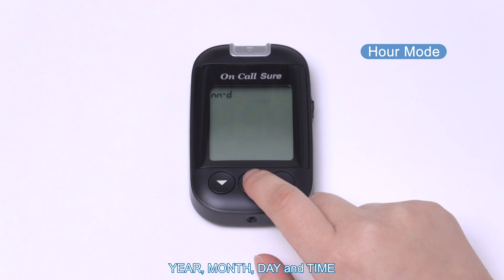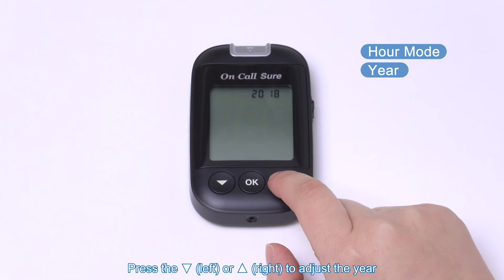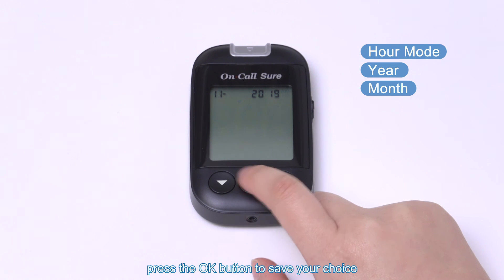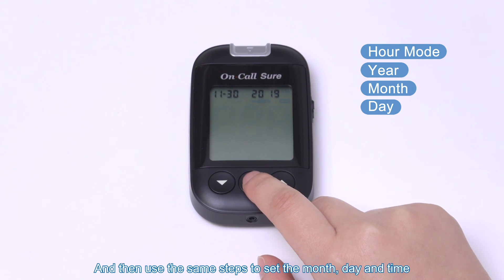Year, month, day, and time: press the left or right button to adjust the year, then press the OK button to save your choice. Use the same steps to set the month, day, and time.